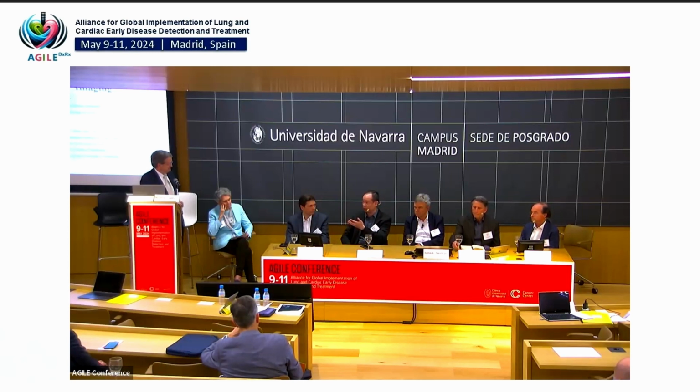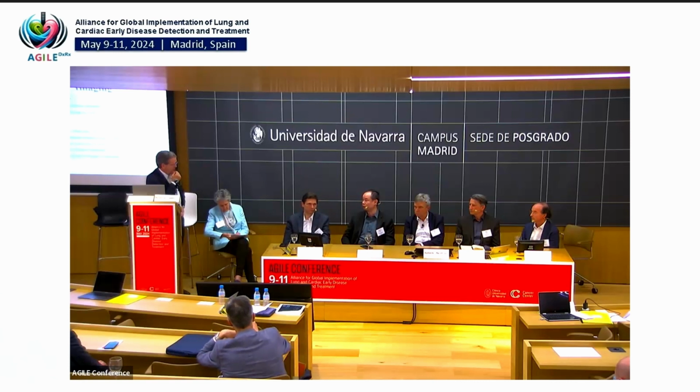Just like if the AI software tells you that nodule is 4 millimeters, you're not going to remeasure every nodule to make sure they're really all 4 millimeters. You're just going to assume they're right. That's the purpose of the software. So it's very tricky in that regard if you rely on these software packages. Okay, thank you. Is it showing you the product of what it's producing, or is it just giving you the answer? You can review the product as well. So you can review that if you want to. Okay. Matthias, any additional thoughts on opportunities for now, conversations?